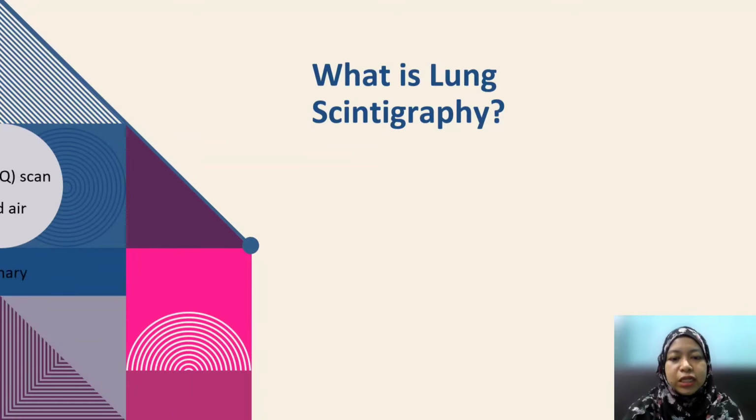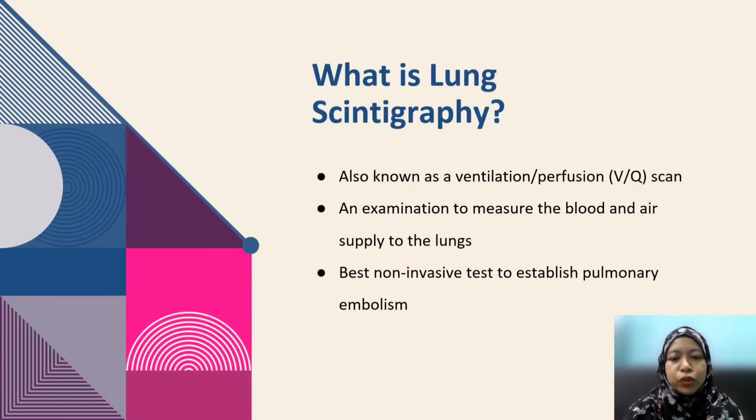What is lung scintigraphy? It's also known as ventilation perfusion, which is a VQ scan. It's an examination to measure the blood and air supply to the lungs, the best non-invasive test to establish pulmonary embolism.